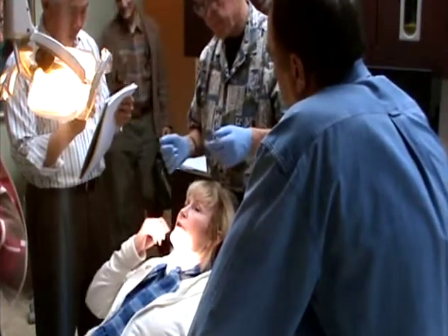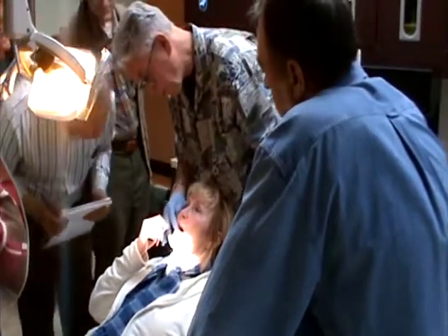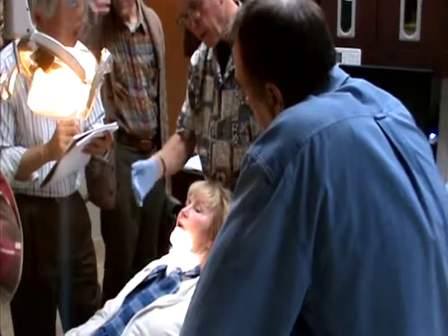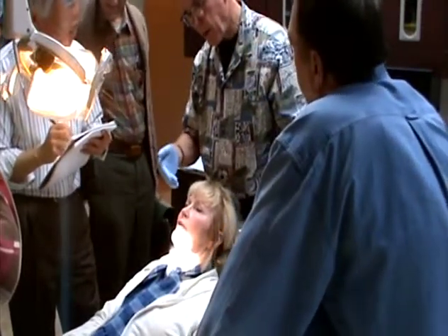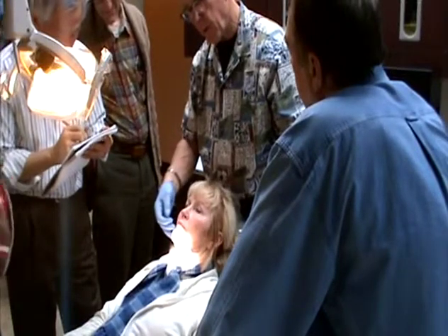Now, where does the up bend go, because I can't see where you're pointing? The up bend goes right distal to your second bicuspid. Okay. Then you bend it up high enough so you can still get it into the molar.